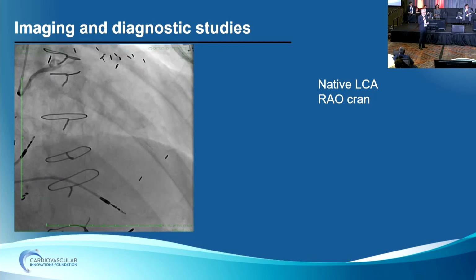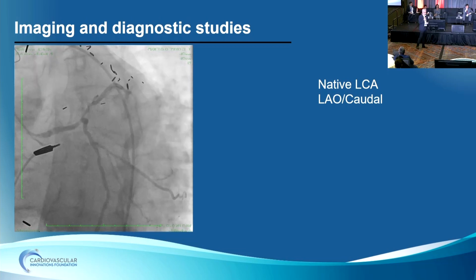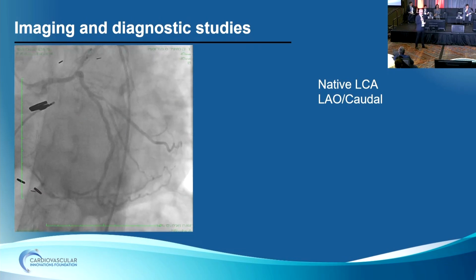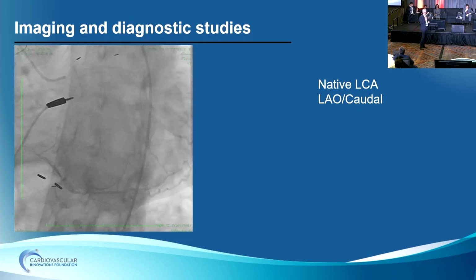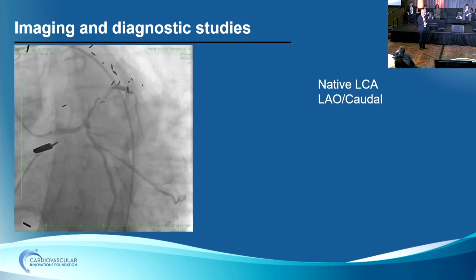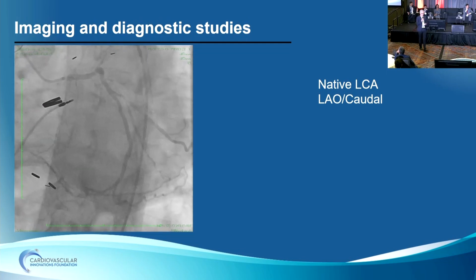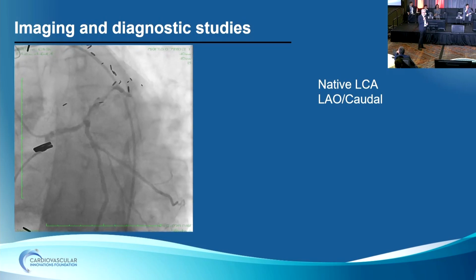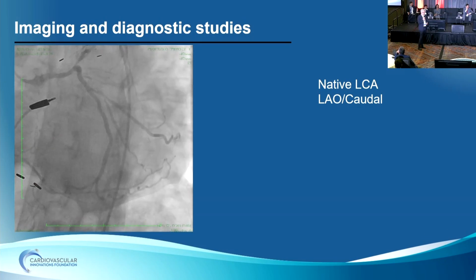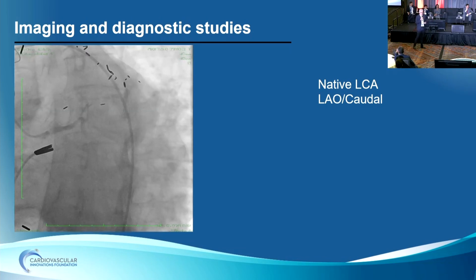You see an epicardial collateral from the circumflex to that right. In the spider view, they were concerned that the distal left main looks hazy. It's not the best angiogram, but it's hazy. You see the competitive flow in the LAD system. You see the very large circ system, maybe some more distal disease too, but mostly concern up at the left main ostium, and again, the right coronary collaterals.